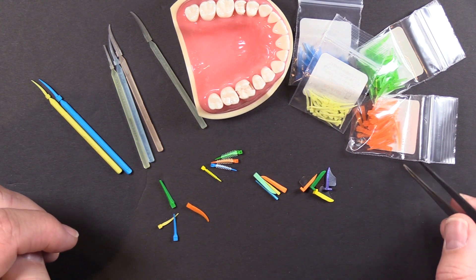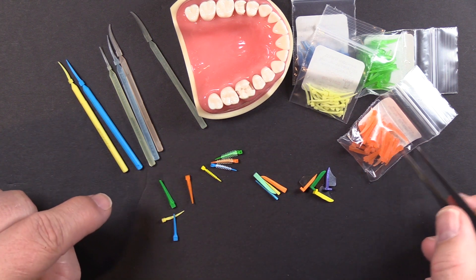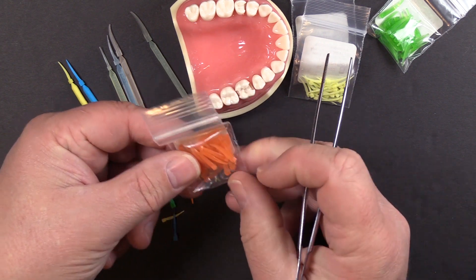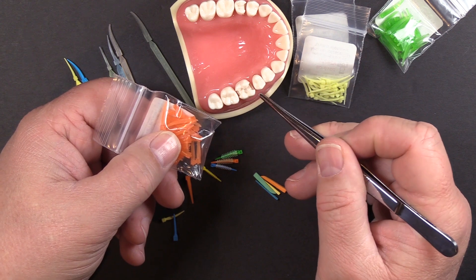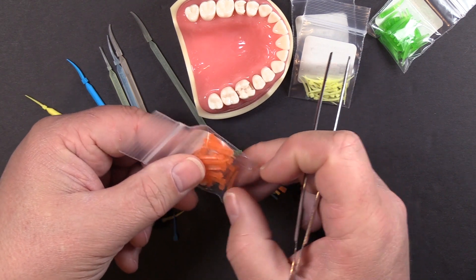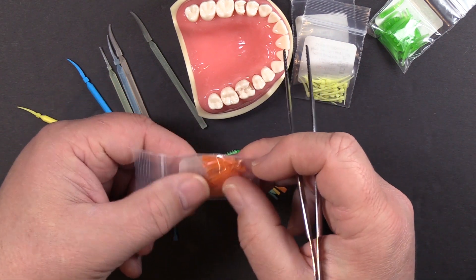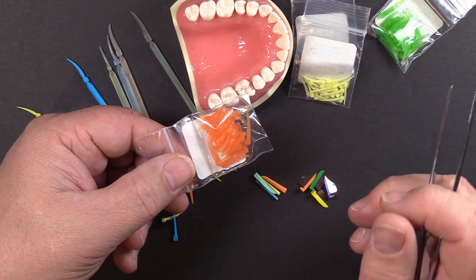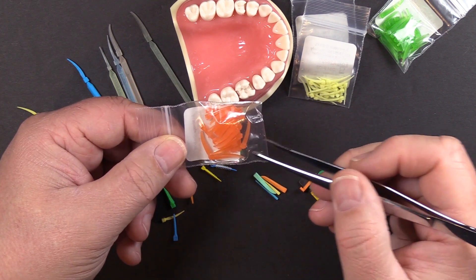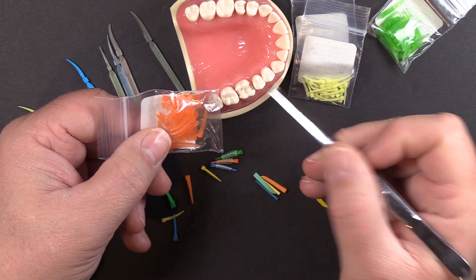A couple years back we came out with the G-wedge, which has essentially the same tip as the Wedge Wand but with an astringent coating — an aluminum sulfate coating that does a great job of reducing interproximal bleeding. Particularly if you've got a patient with some perio issues, it can be very difficult keeping your restoration area clean and dry, and the astringent coating really helps with that. I'm keeping them in the pouch so I don't get the coating on my fingers. When you remove the wedge, just make sure you give the interproximal space a little extra rinse.